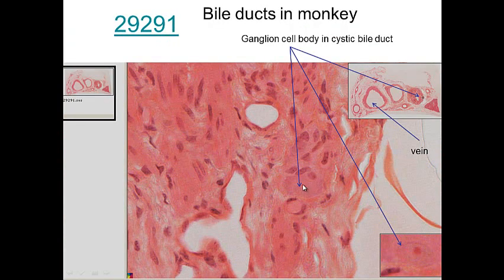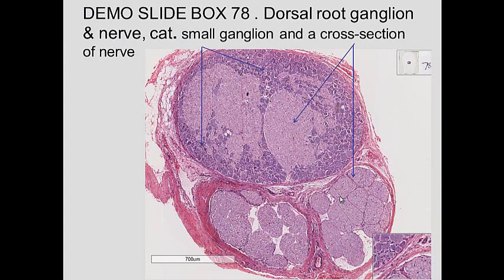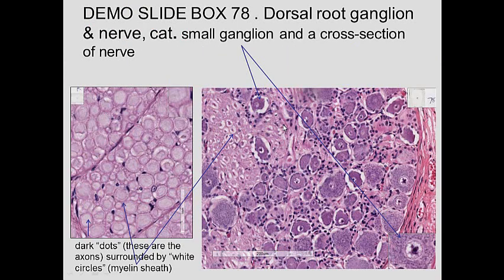Here we see multiple ganglion cells — one here, another one, another one right there. You can see the nucleoli very clearly in these. So in the various tissues you get signals coming in and you have neuron cell bodies — ganglia — that are located in the tissues themselves. Here we see the dorsal root ganglia. We see some nerves coming down through here. There are neural cell bodies of the ganglia in the dorsal root, and then these are actually nerves going through.